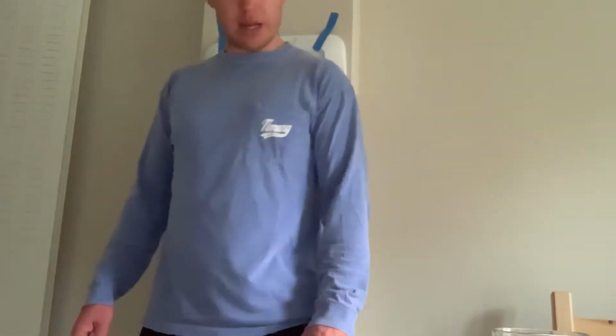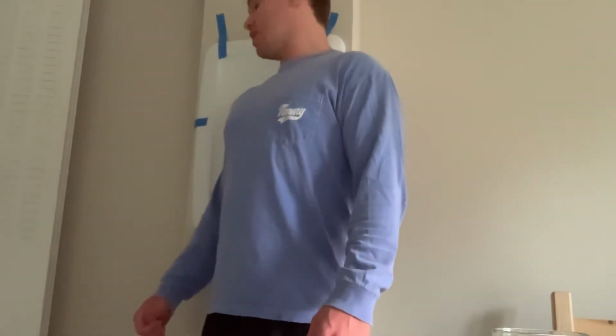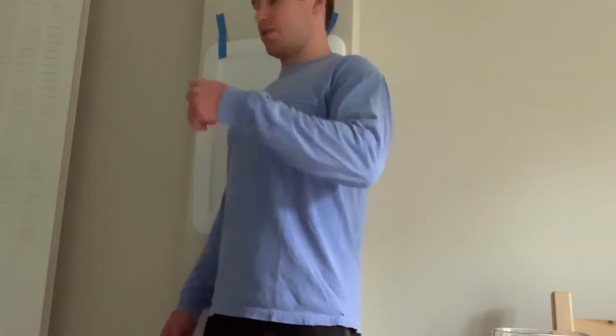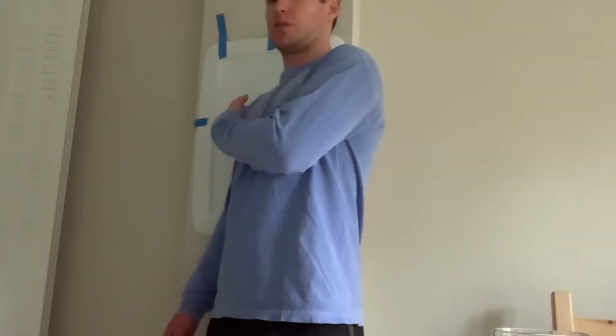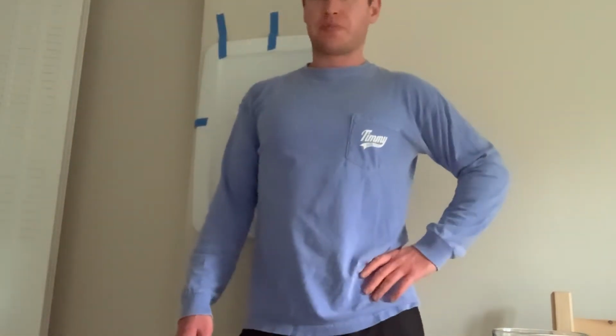Next, we'll have the AP Grashey view. So the patient will stand with their back facing the cassette at a 30-degree angle. The central ray will be directed perpendicular to the arm just below the head of the humerus and the little divot that you can feel. And this will give us a lateral view of the glenohumeral joint.